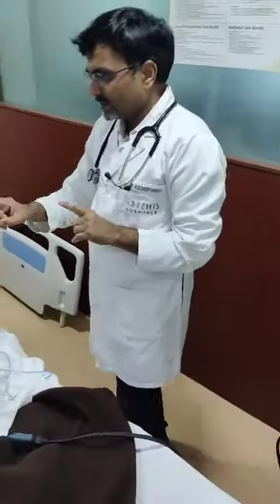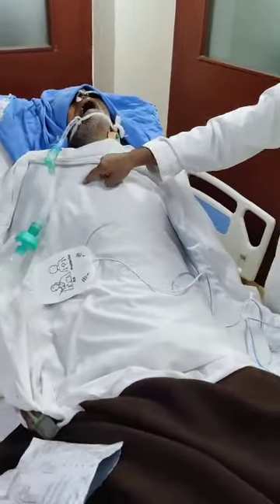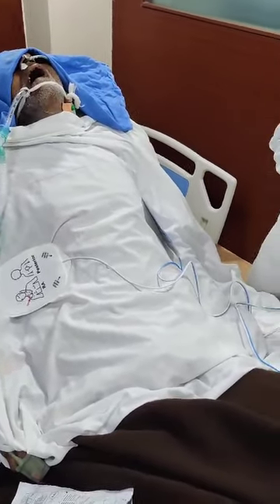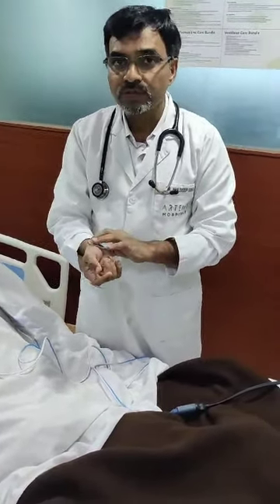So as we confirm once again, we check the circuits, we check the pads, and we have fixed output and fixed rate, as per our demand mode and the fixed mode. The pacing will keep on happening. So this is the way, and make sure that you are checking your patient every time. You are checking pulse, blood pressures, hemodynamic instability, and in terms of that we will check the response of the patient.